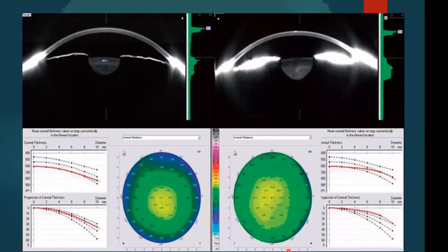But what I want to tell you is, one is the pachymetry is 600 plus, and this percentage thickness corneal curve that we see is flattened out. So you should know one thing, that this is not an ectasia that we're talking about. The other thing is that you see there is increased reflectance of the iris structure. So this is a Scheimpflug image where this is a normal patient's cornea, this is the iris, and this is the lens. On the right hand side, you are seeing that there is increased reflectance of the iris structures.